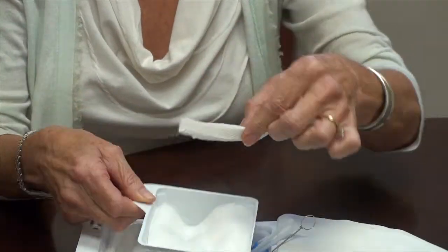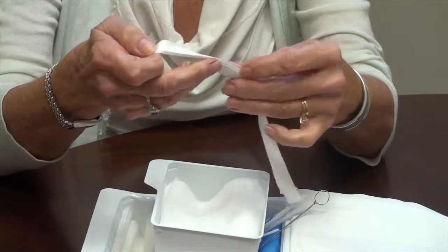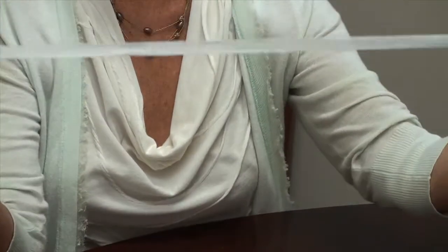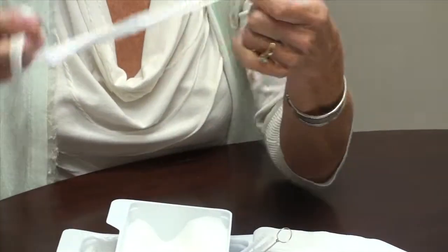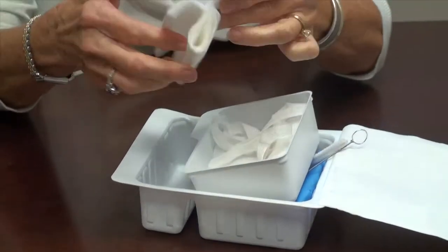You also have a new set of trach ties. It will open up into one long piece, and the DVD will show you how you want to apply it and how to attach it to both sides.